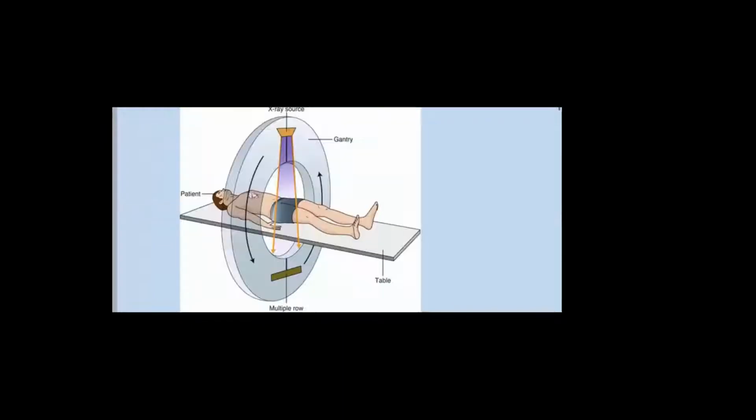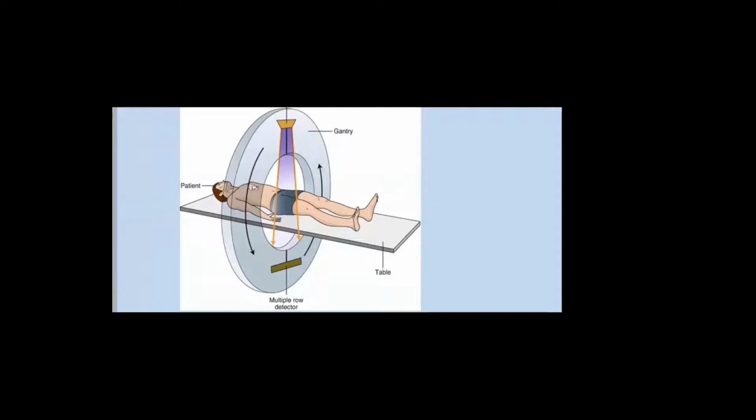So this is the hardware of cardiac CT. It resembles any CT. The components of the hardware are the gantry, which is the moving part, and the gantry houses two main components: the X-ray source on top and the multi-detector at the bottom. The patient on the table moves into the gantry while the gantry is moving, so the patient is scanned and the images are obtained.